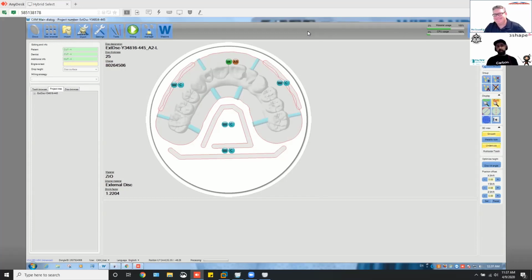And there's people out there that do it with a 10-hour, 14-hour cycle with no beads, no sintering brace. Definitely don't use the 1 millimeter beads. Don't use the big ones, because those get stuck in, and you say it's zirconia, it can't distort. Oh, well, let me tell you, when beads get stuck in places, it does. I've had margins bow out, and I've had an open margin, and the design's fine. So definitely use a 0.5 millimeter sintering bead, the fine, they call it zirconia dust. Use that, even in crown and bridges. I don't use the big ones.